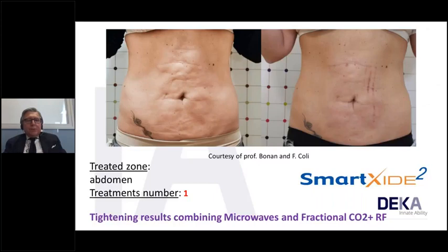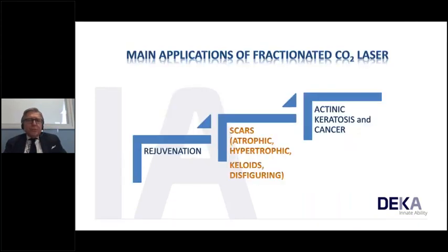Well, you see one of the results. I put this slide just to show you the sign of the fork with the radio frequency, indicating that we used microwave, fractional, and radio frequency. And you see here the combination.